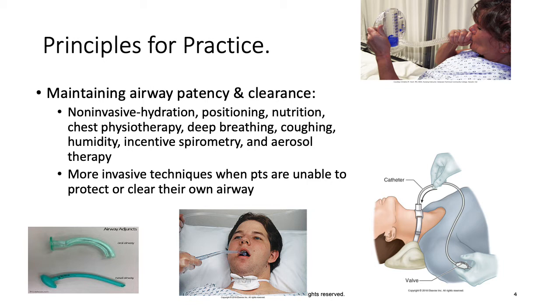Humidity is important. Maintaining adequate humidity will ensure that the secretions also stay thin. Decreased humidity can produce thick secretions. You learned when you give supplemental oxygen to a patient, if you have a nasal cannula and you're giving more than 4 liters per minute, then you want to humidify that air because it sort of hurts because it dries the nose so much. So adequate humidity is very important.